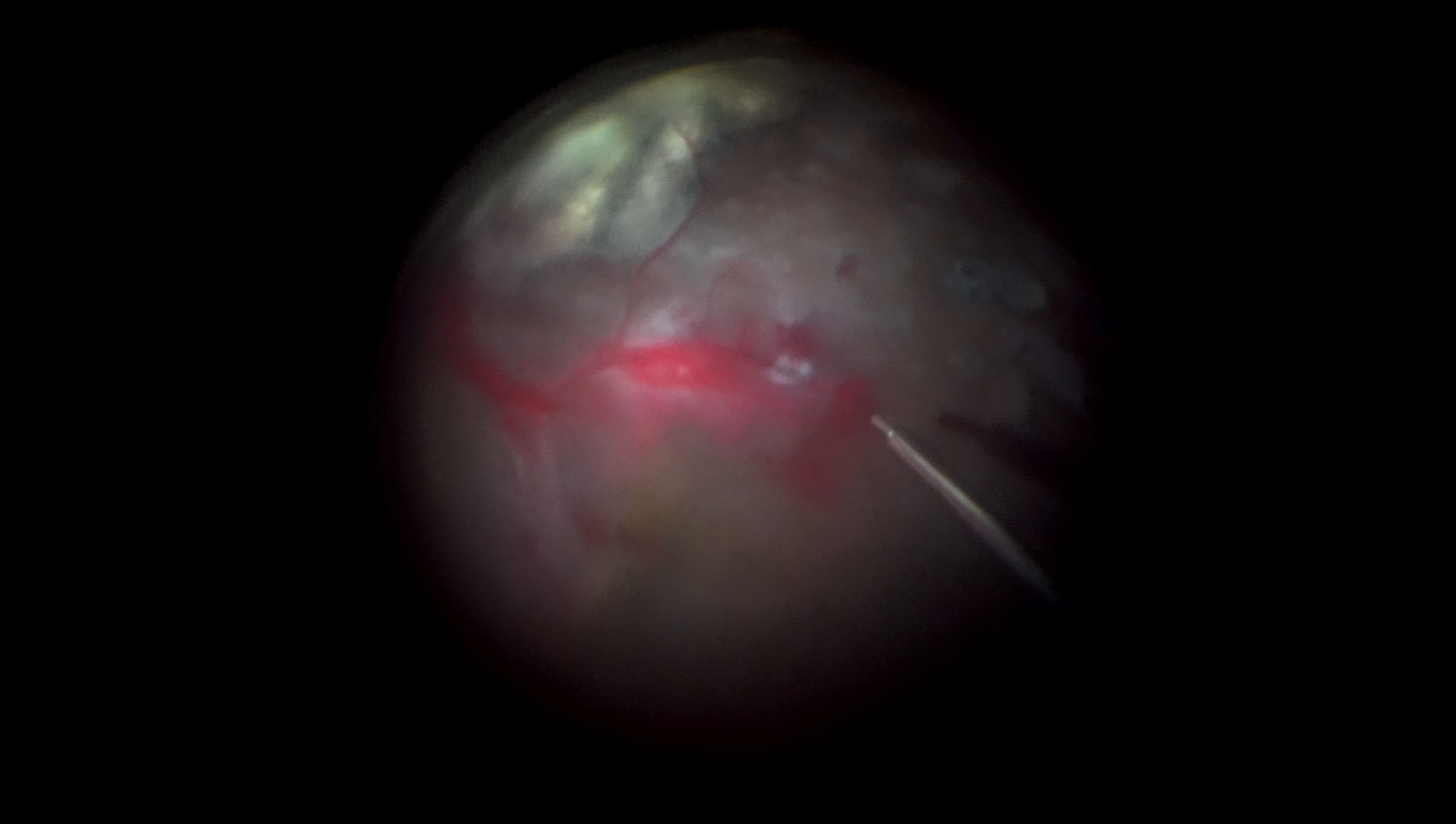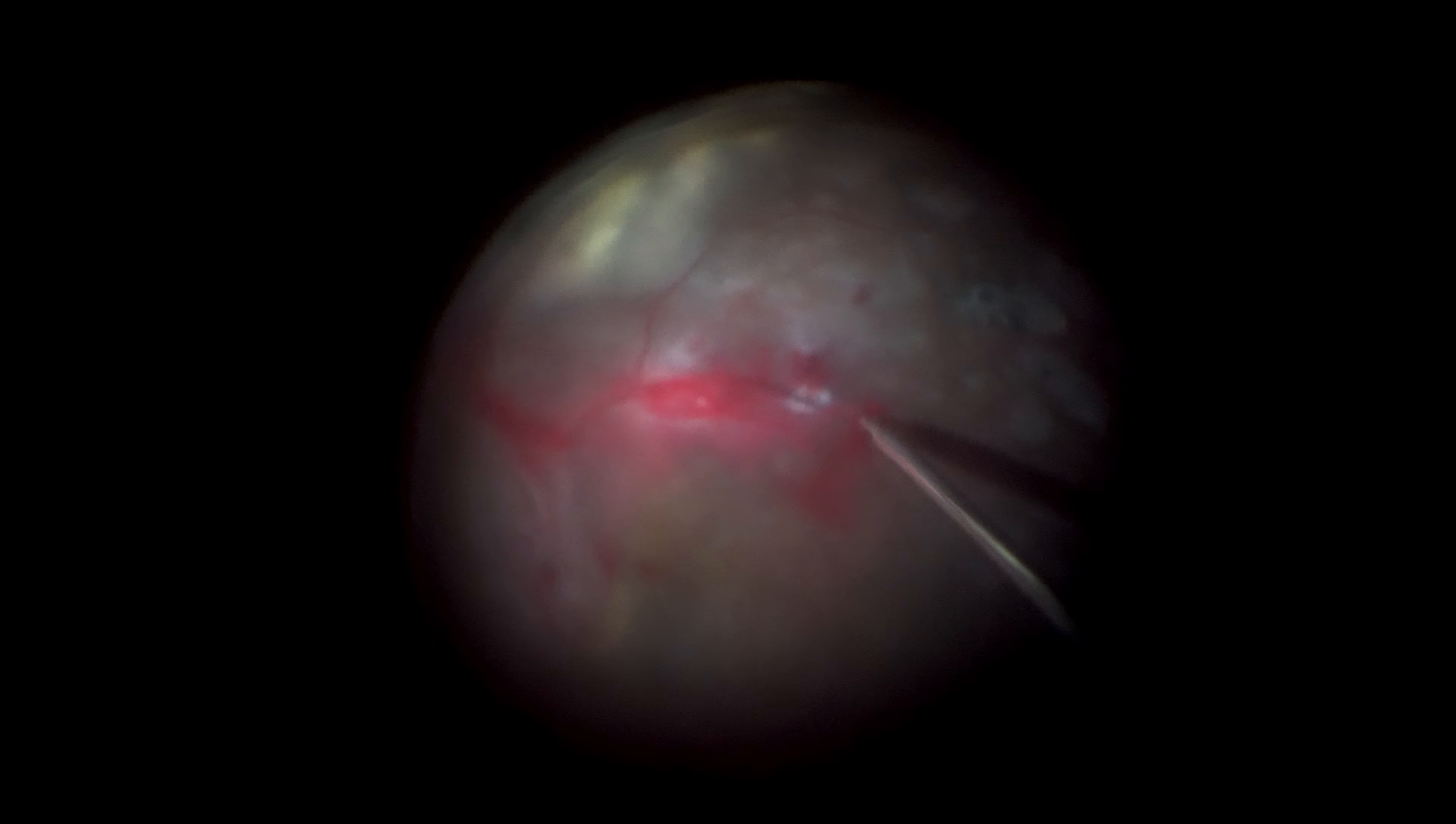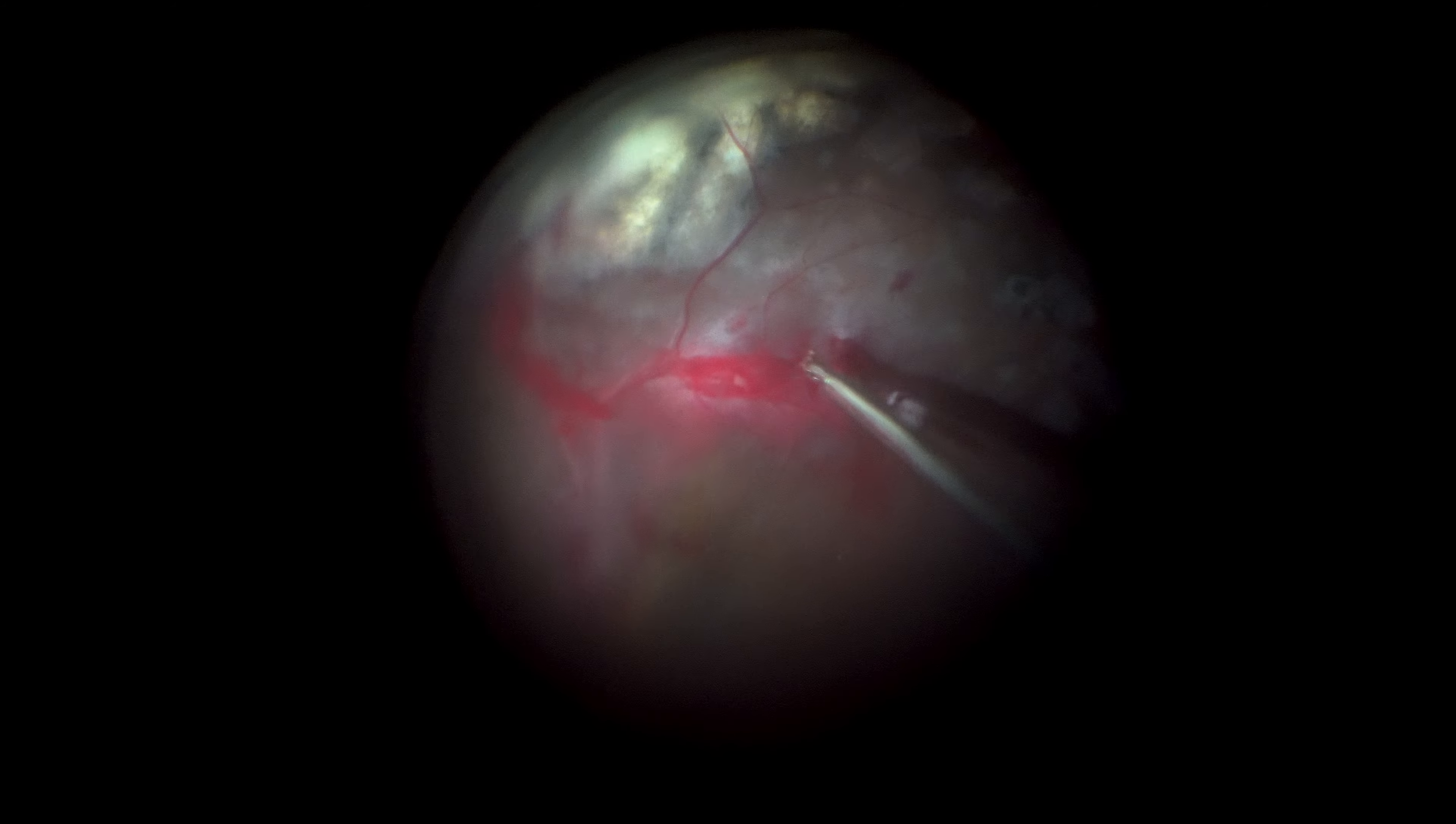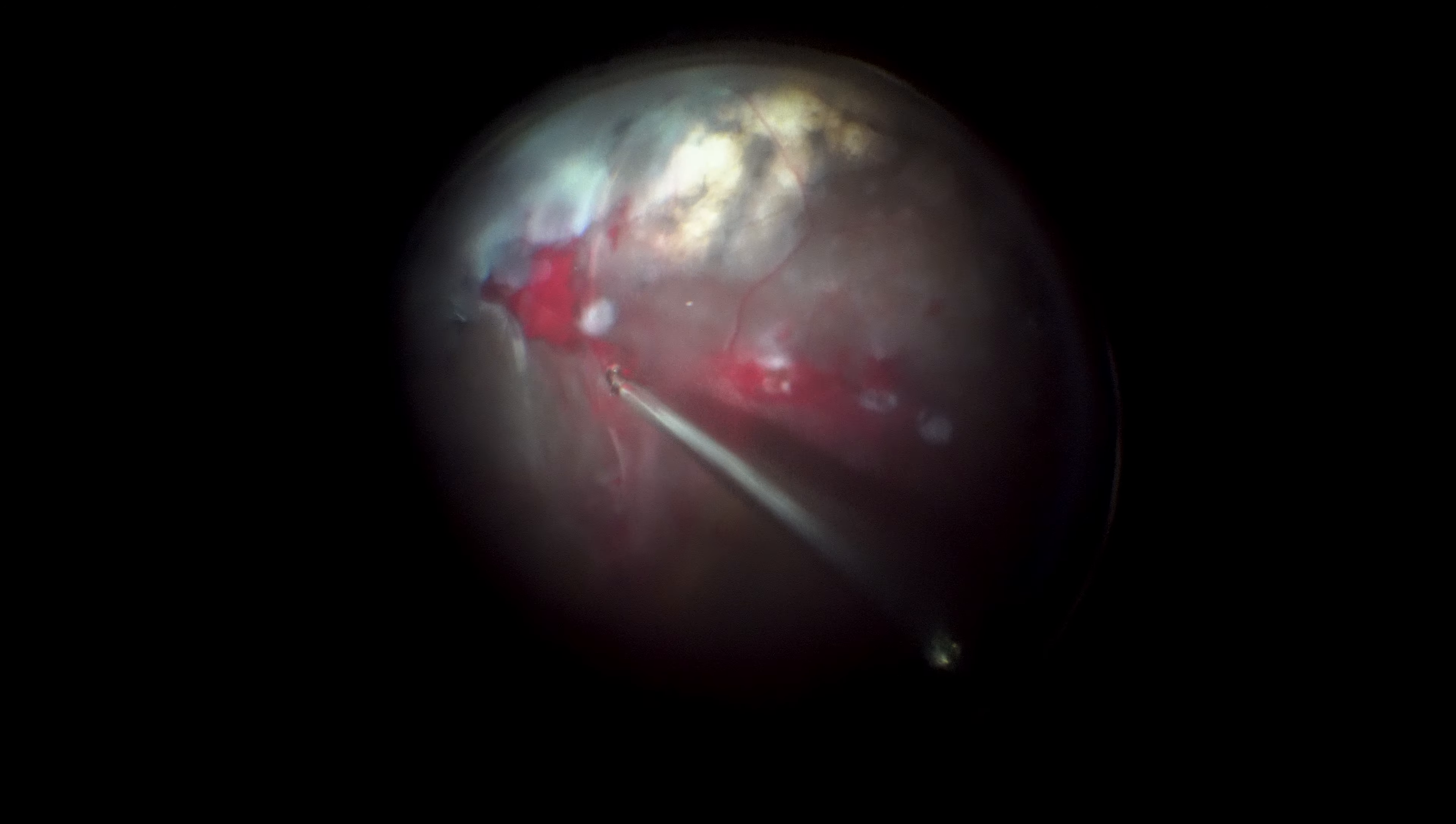Endodiathermy is now used. Of course, you've got to choose the right places, avoid the main vessels, and be very gentle in this maneuver. This nasal bleeding neovasculature deserves attention.